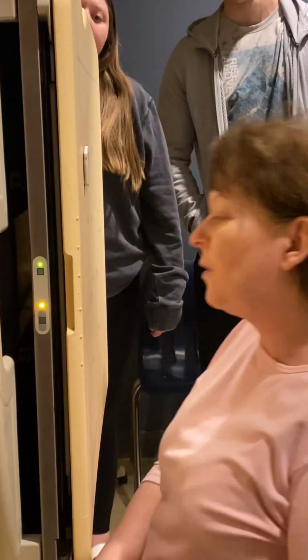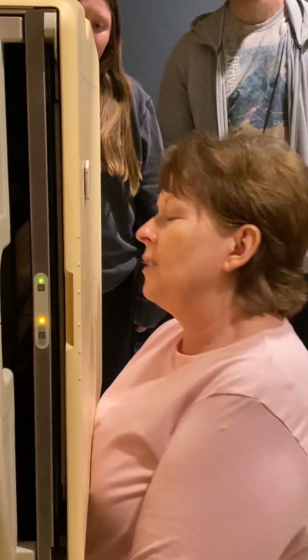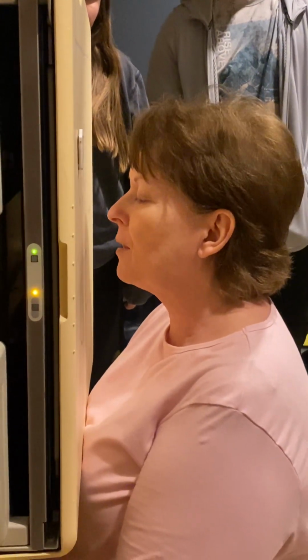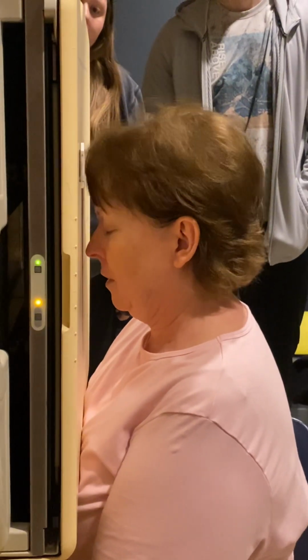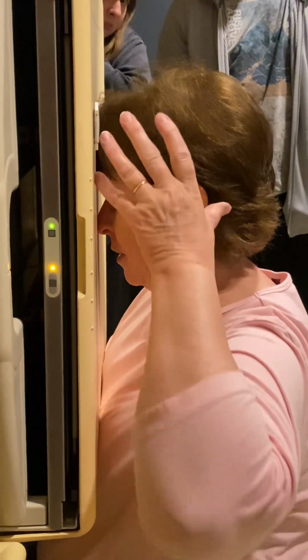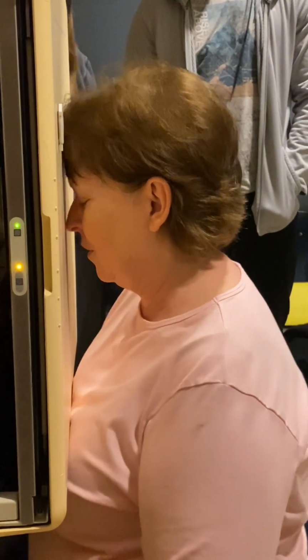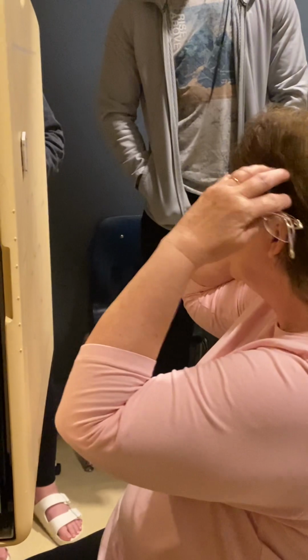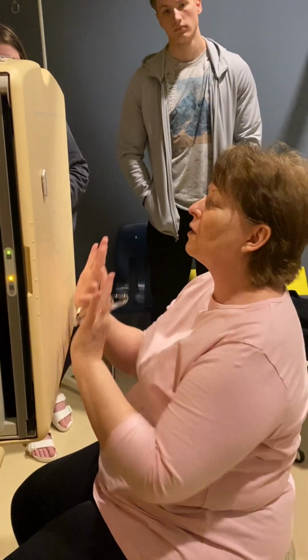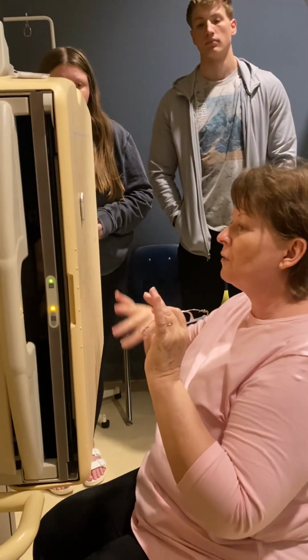It's tipped forward versus you have to have your patient get on each side of this. You have to set them up. You have to smash them in. Then have them do this. Do you see what happens to the skull? It sets up like it should. Does that make sense? Versus, do you see the difference on the skull? That makes a huge difference. So you have to set your patient up, you have to smash them in, and then have them look down, put nose and forehead on board.